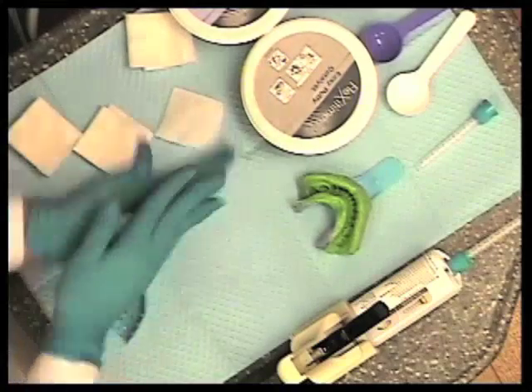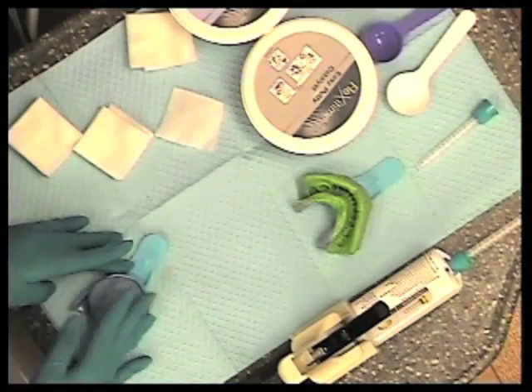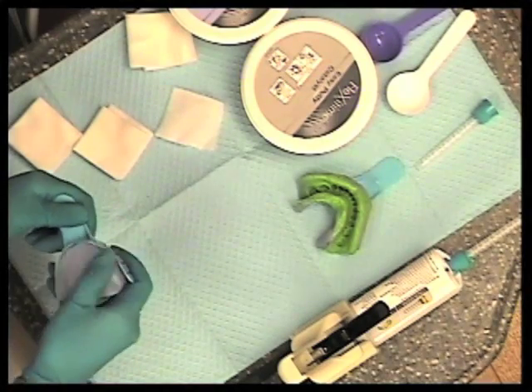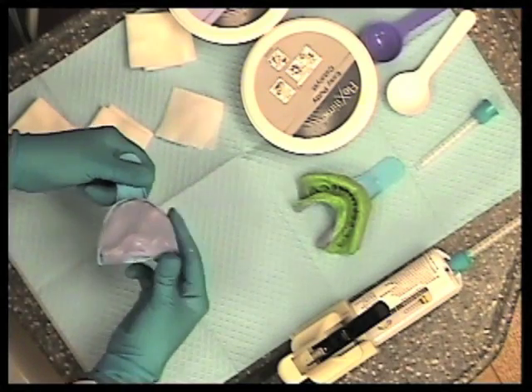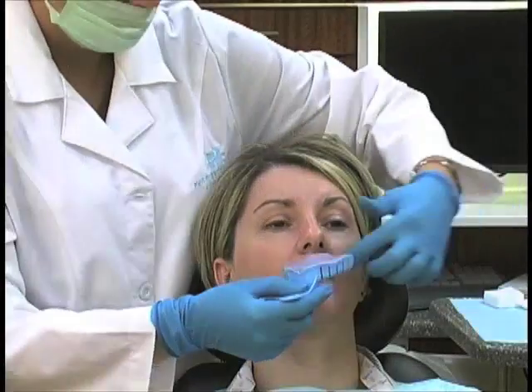And then she's going to roll it up. And again, in this one, not so much of a donut shape, but getting it to go uniformly across the entire width of that maxillary tray. So now we're going to go ahead, just like before, seat this in the patient's mouth.